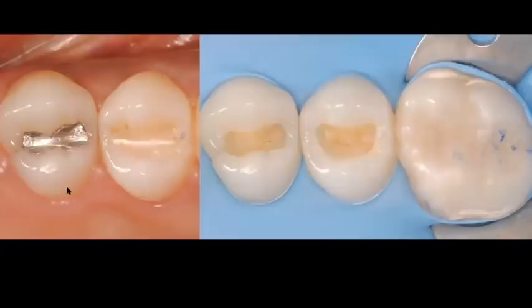So on the left-hand side, you can see what's going on with this patient. She had an amalgam restoration and a composite restoration on both of these premolars. The composite restoration, you can see, had already some staining, very flat, very little anatomy left. The amalgam, you can see a little bit of fracture on the margin. So, very old restorations. They were both ready to be removed and replaced. So that's what we did.